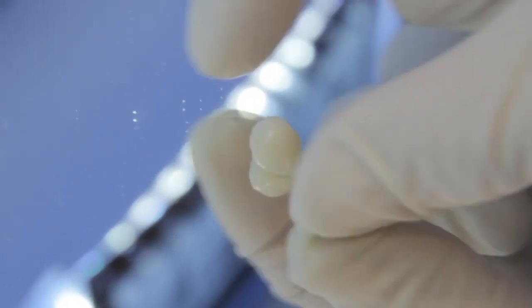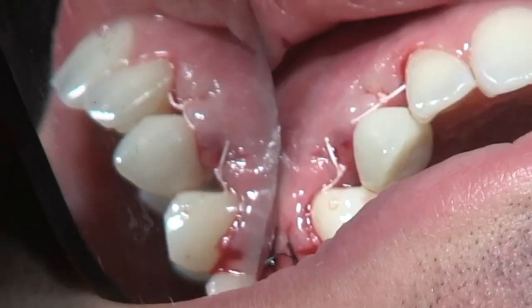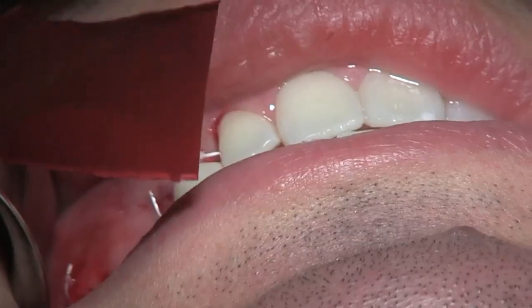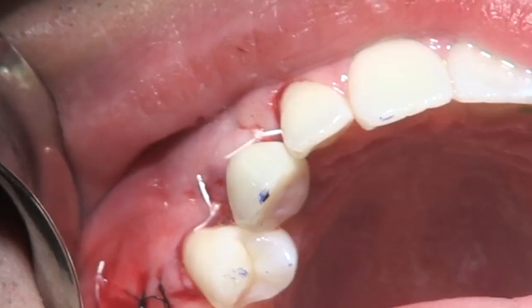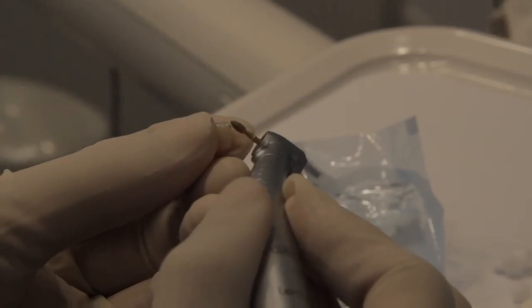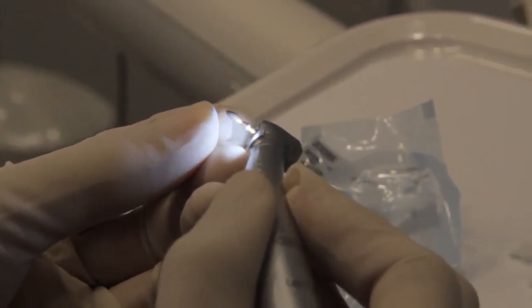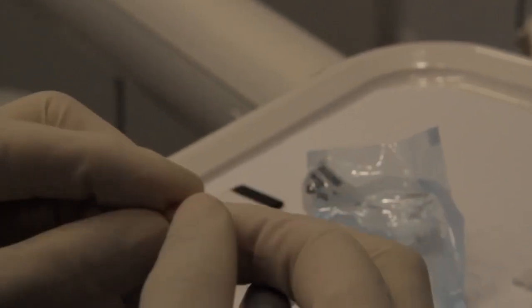Now the temporary crown can be inserted on the abutment and evaluated for marginal fit and for occlusion and lateral forces so that there's no contact in this immediate temporization concept. Any premature contact is carefully being removed prior to insertion of the temporary crown.